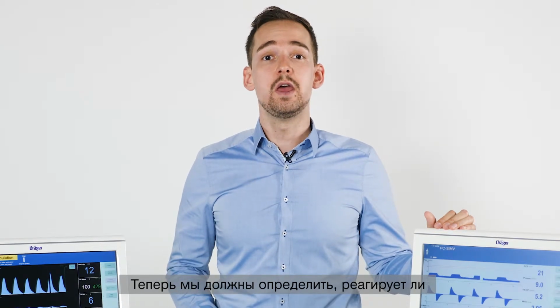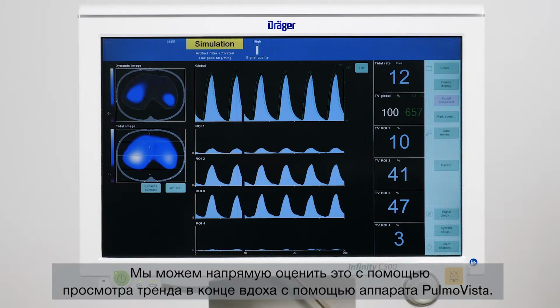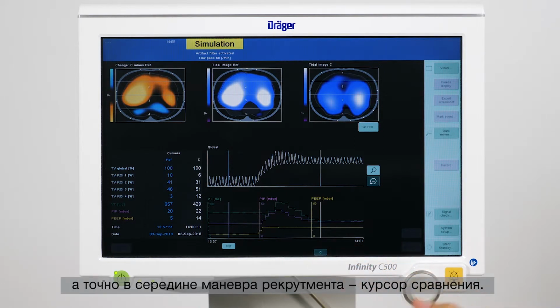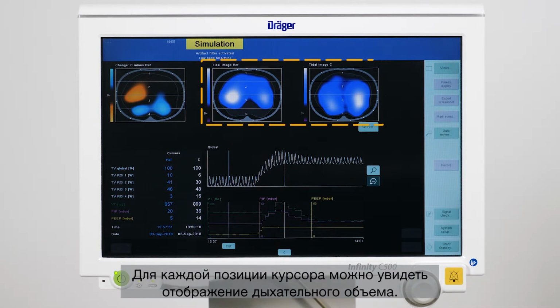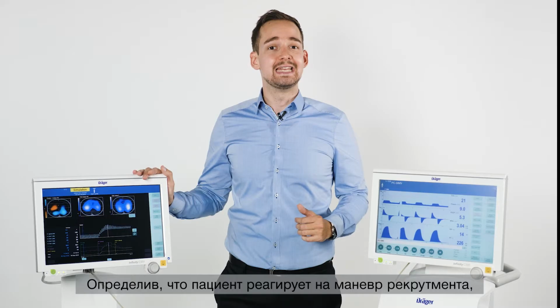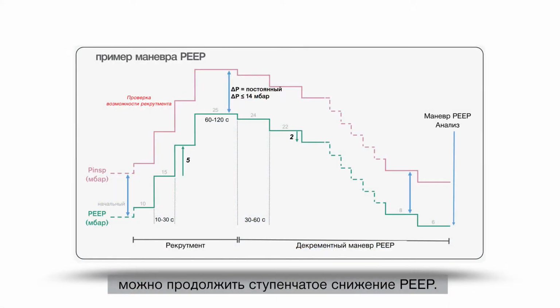Now, we have to identify whether the patient is a responder or a non-responder to the recruitment maneuver. We can directly assess this with the help of the end inspiratory trend view of PulmoVista. I'm placing the reference cursor before the recruitment maneuver and the comparison cursor right in the middle of the recruitment maneuver. We can see a tidal image for each cursor position. In this example, the recruitment maneuver was able to significantly improve ventilation in the dorsal part of the lung.